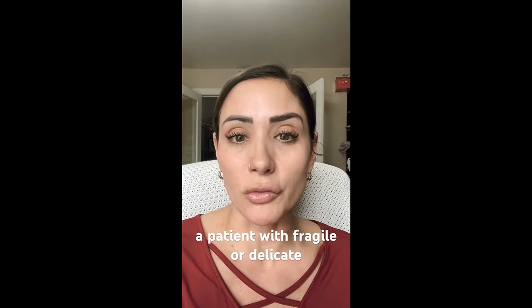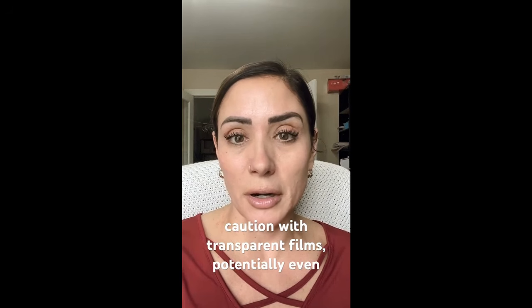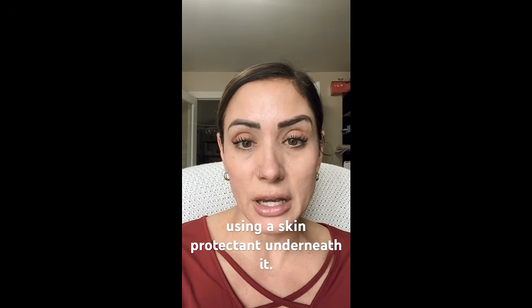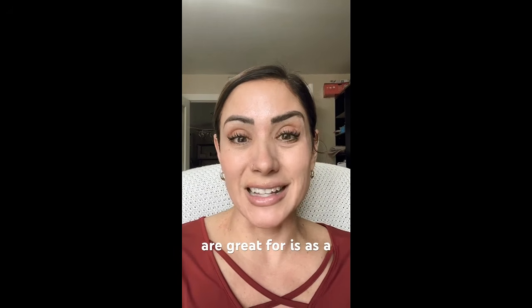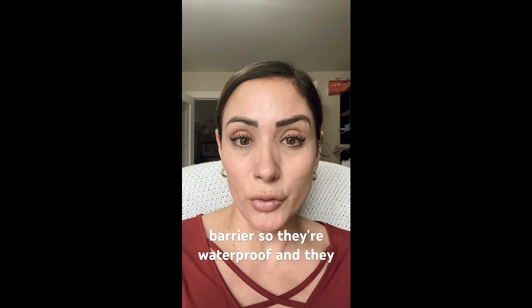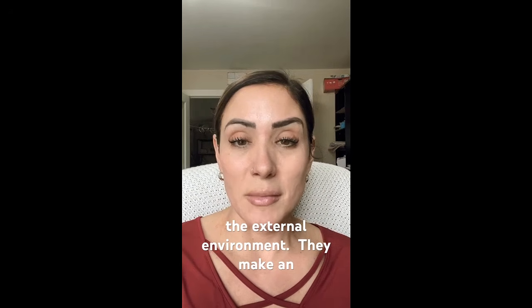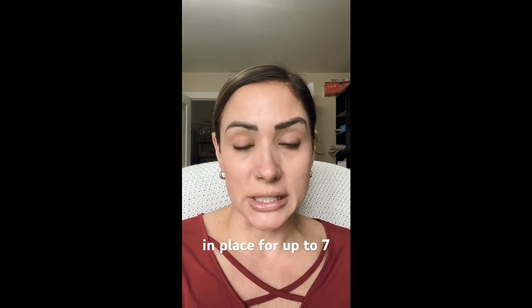If you have a patient with fragile or delicate skin, you would want to use caution with transparent films, potentially even using a skin protectant underneath it. The other thing that these are great for is as a barrier. So they're waterproof and they can help protect the wound from the external environment. They make an excellent secondary dressing. They can stay in place for up to 7 days.